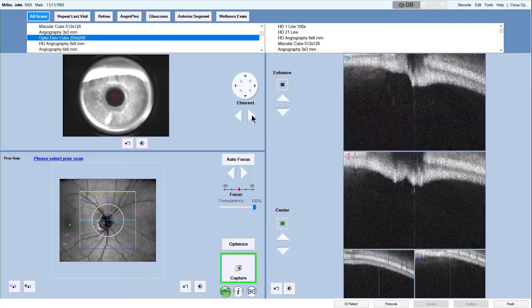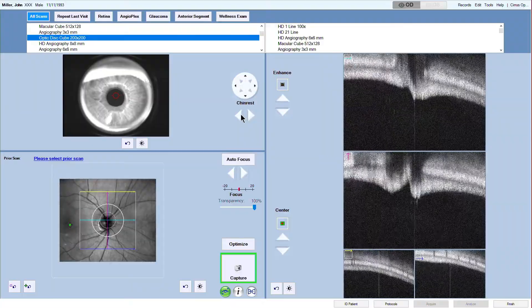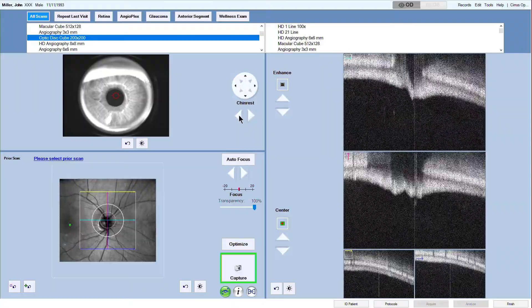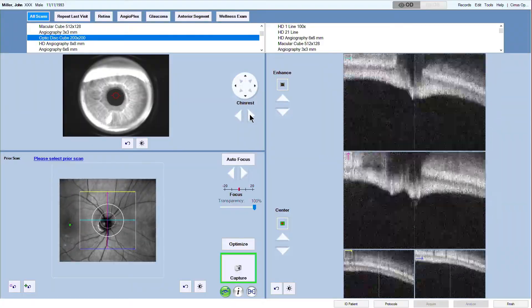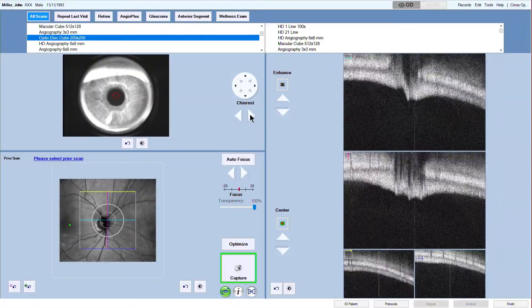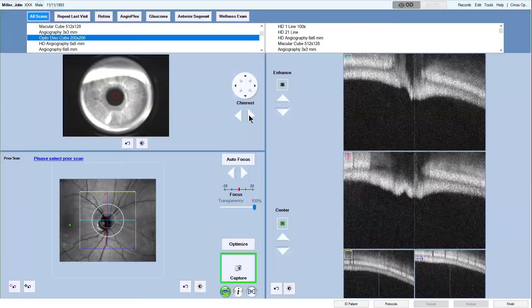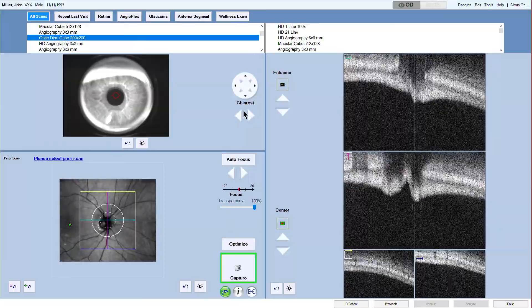Use the two lower big buttons in the iris viewport. This will bring the patient towards or away from the camera lens. Remind your patient to keep their chin down and to move with the chin rest.